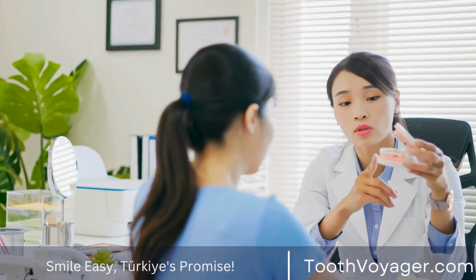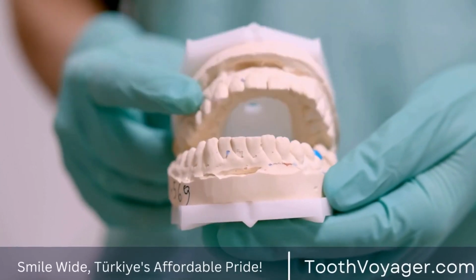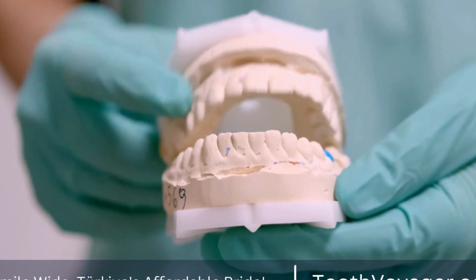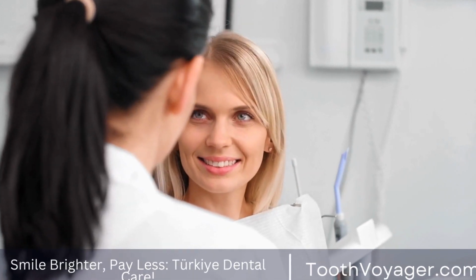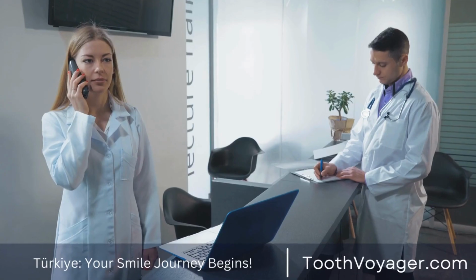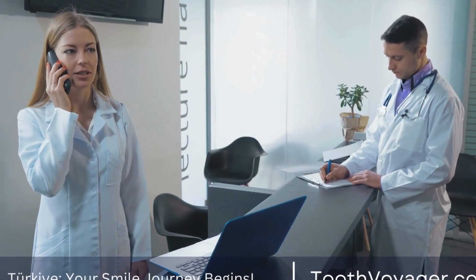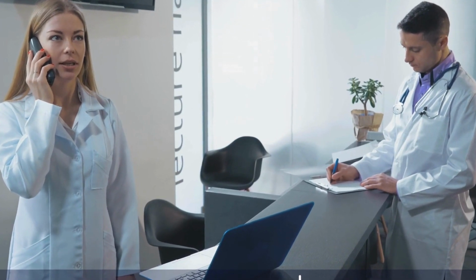Why is bone grafting necessary for dental implants? In order for a dental implant to be successful, it must have a solid foundation in the form of healthy, dense bone tissue. If a patient has experienced bone loss in the jaw due to factors such as tooth loss, gum disease, or trauma, they may not have enough bone to support a dental implant. Bone grafting helps to address this issue by adding new bone tissue to the affected area, creating a stable and secure foundation for the implant to be placed.